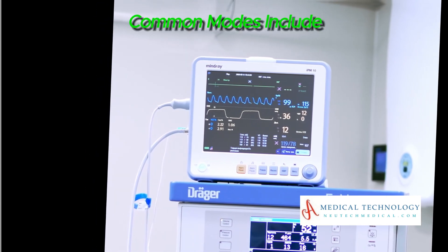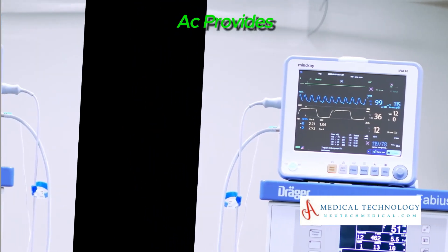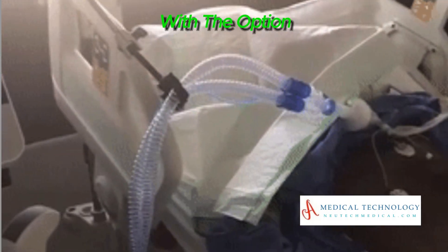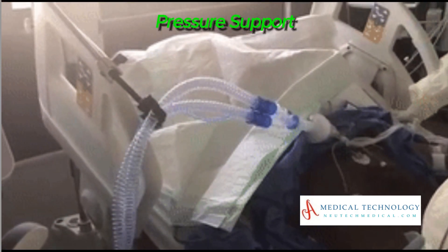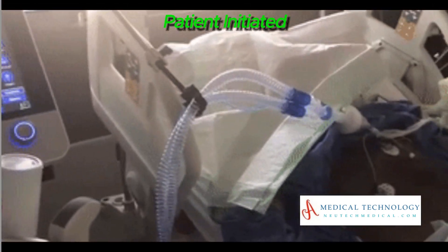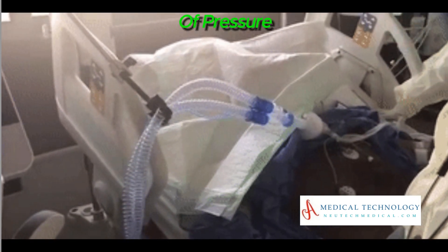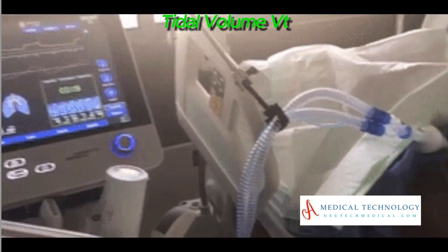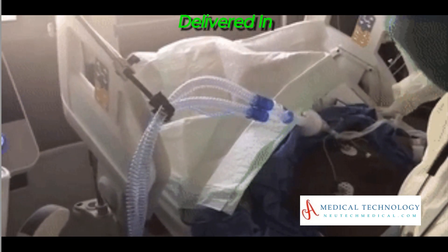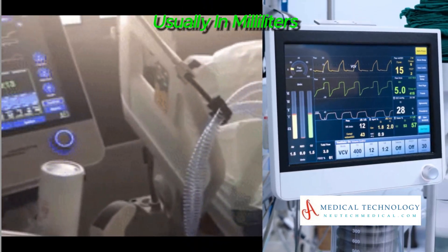Common ventilation modes include assist-control (AC), which provides a set number of breaths per minute with the option for patient-triggered breaths, and pressure support (PS), which augments patient-initiated breaths with a set level of pressure support. Second, tidal volume (Vt): set the volume of air delivered in each breath, usually in milliliters.